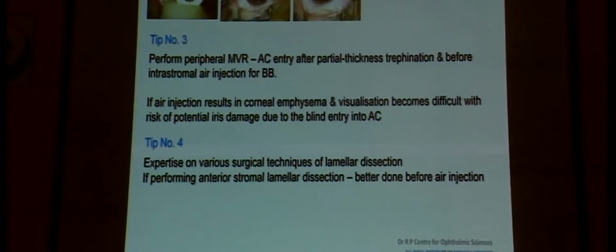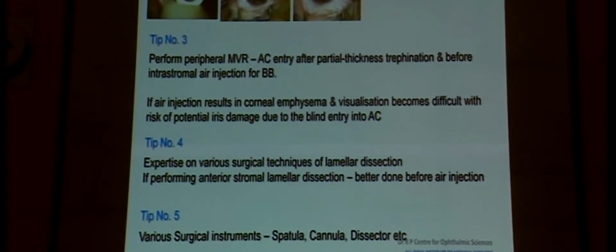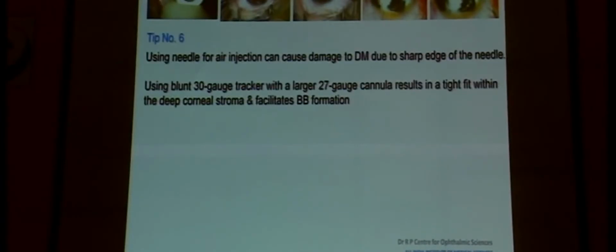And as Rishi rightly pointed out, you should learn to master your manual dissection techniques as well, so that in case you're in trouble, you will be able to convert it into a manual DALK and not into a penetrating keratoplasty. Again, there is a gamut of instruments which have been described, so learn to use these instruments. There's no shortcut to learning. The learning curve of DALK is slightly longer than other procedures, perhaps even endothelial keratoplasty DMEK, but there is a good set of instruments available which help us to achieve the big bubble. I'll subsequently show you those instruments, quickly run through them after I finish the tips and the pearls.